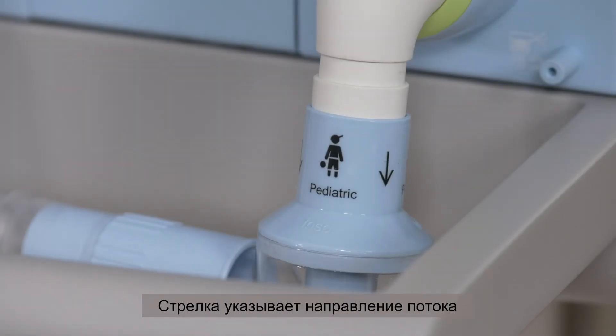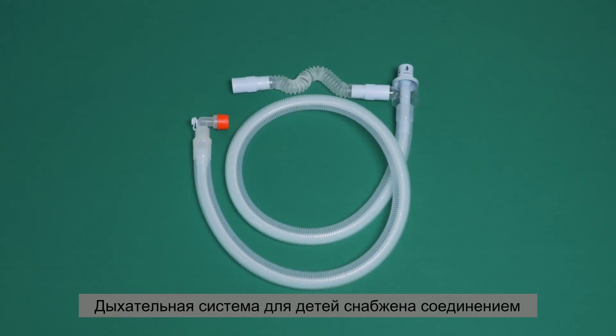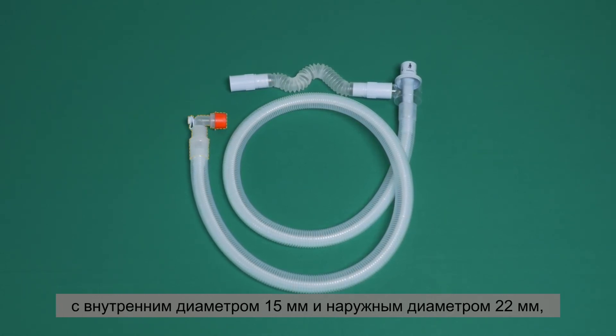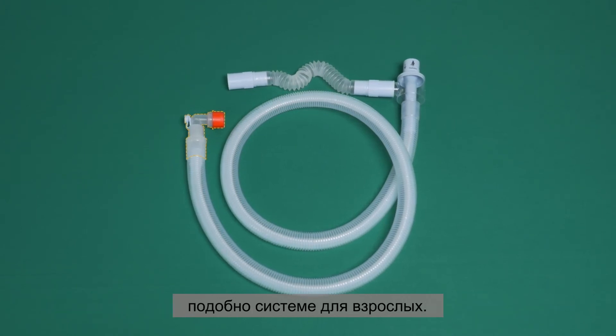The flow direction is indicated by an arrow and identifies the inspiratory connector. The breathing system for pediatric patients has a connection with a 15 millimeter inner and a 22 millimeter outer diameter, similar to the adult system.